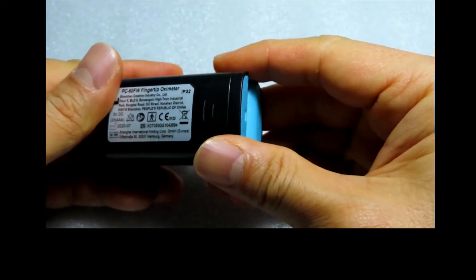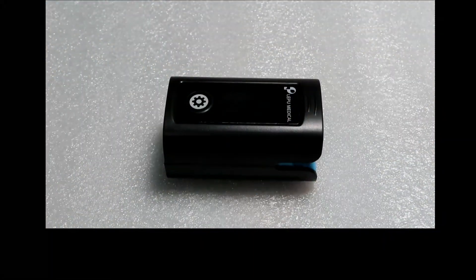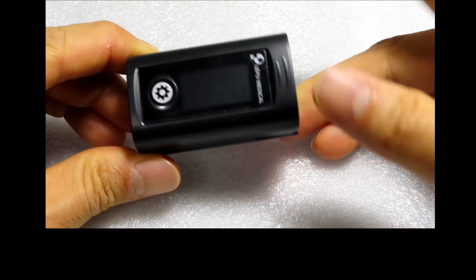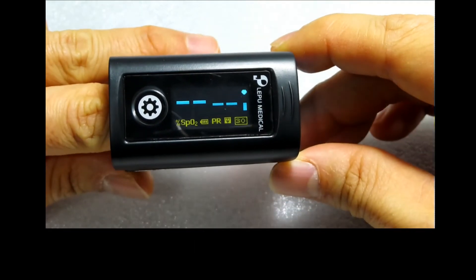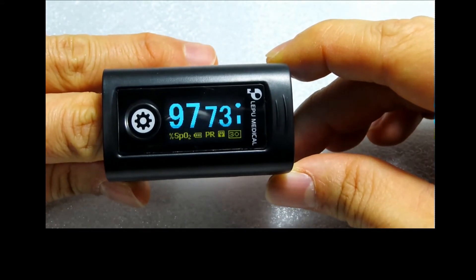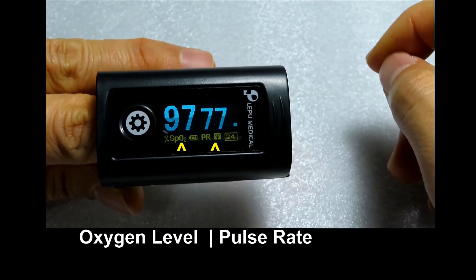So let's install the battery. To use the oximeter, simply press on this end here and insert your finger. It will automatically detect and start measuring. Our reading is 97% oxygen level with a 77 pulse rate.